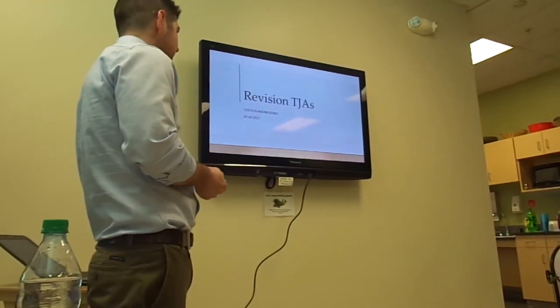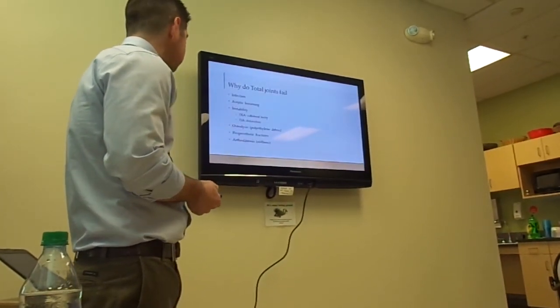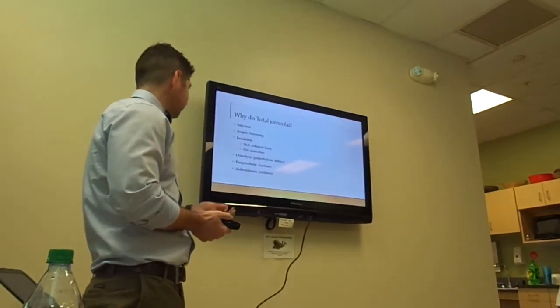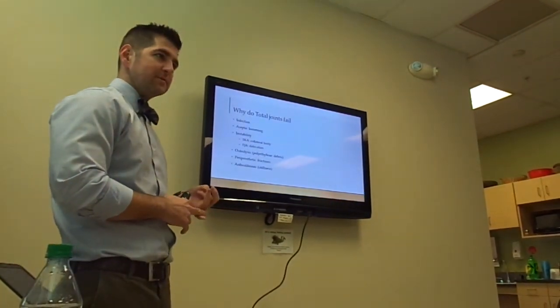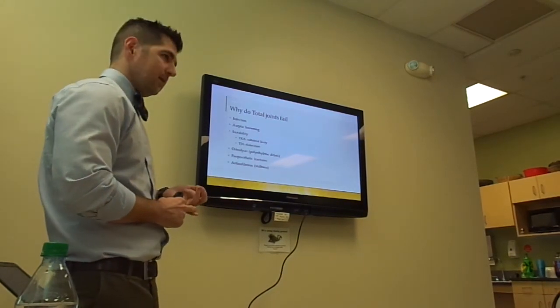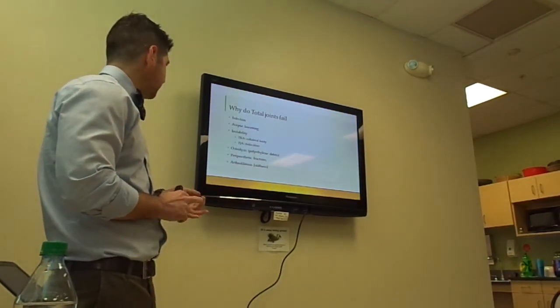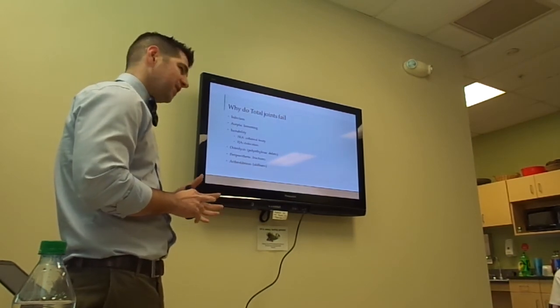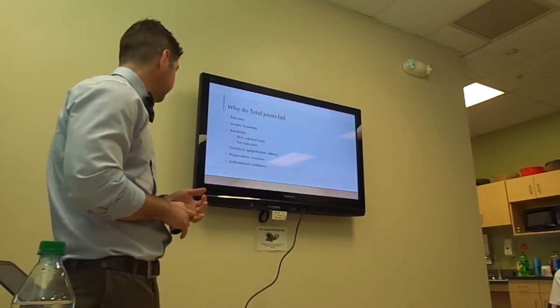Do now that I'm here in the practice. So probably the most common question is going to be, why do these things fail? Well, infection, you guys have probably seen some of those. Those are probably the devastating ones. Aseptic loosening, that's actually, in the most recent literature, probably the most common reported reason to revise a total joint.